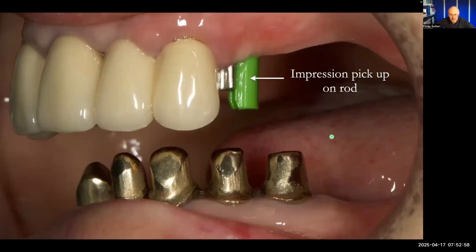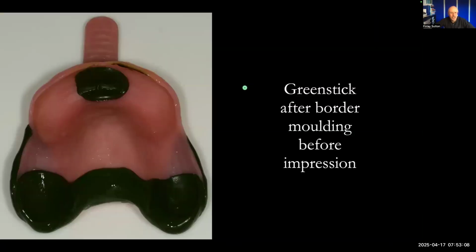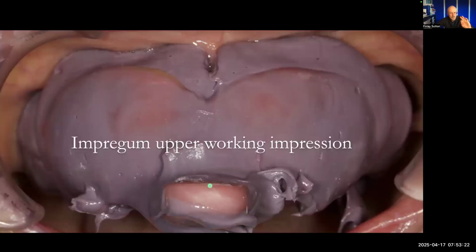So the impression pickup is placed onto the rod in the mouth like that. It's placed both sides like this. I then take an impression tray and I do border moulding with green stick. I just imagine that these free end saddles are just like a complete denture, and I do my border moulding just as is. And then I like to use Impregum for these. So this is Impregum regular, just like I would do for an implant restoration. Very, very accurate and solid.